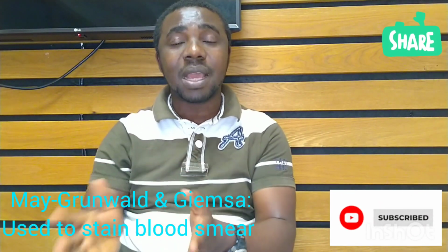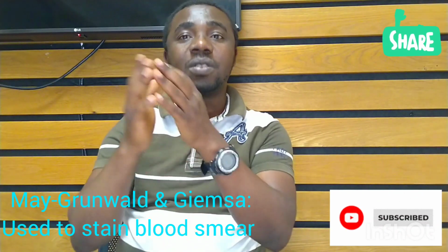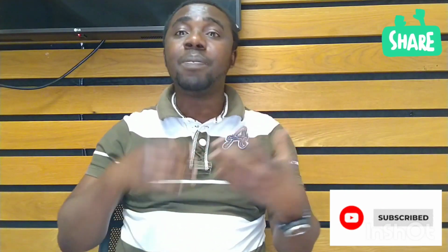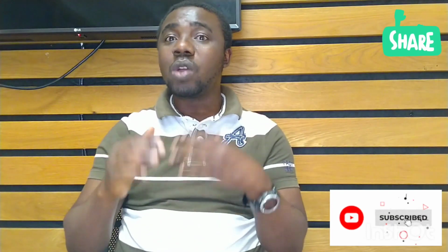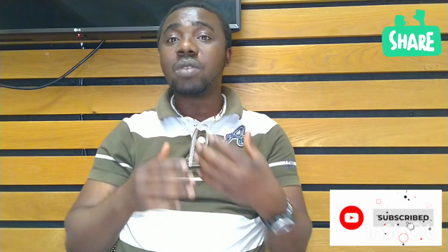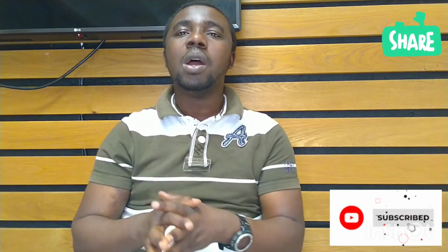The May-Grunwald stain is used for the staining of the blood. And of course, the Giemsa is also used for staining of the blood. Remember that I've told you that these stains are neutral stains. They can stain both the acidic part of the cells and also the basic part of the cell. Remember that when we talk about the acidic part of the cells, you might be looking at something like the nucleus, and when you talk about the basic part of the cell, you're looking at something like the cytoplasm. So anyway, they stain both of them.